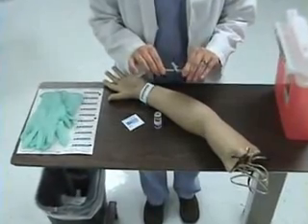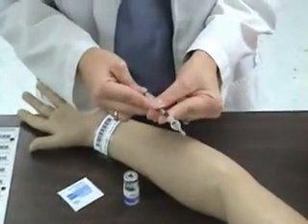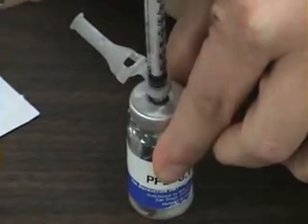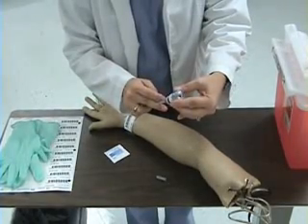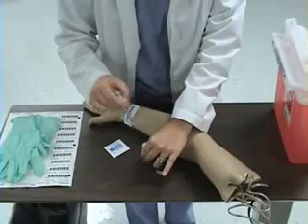I'm going to begin by removing my cap and pulling the plunger back to the 0.1 mark on the syringe. With my vial on the tabletop, I'm going to inject air into my vial. Then I will invert and withdraw the medication. I will then return the vial to the tabletop and remove my syringe.